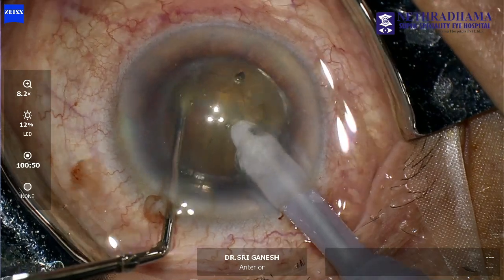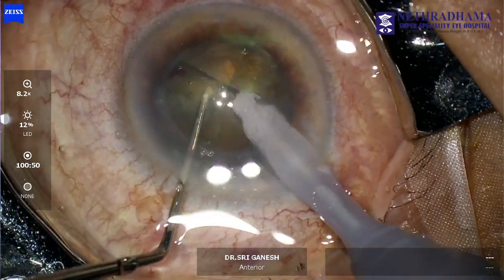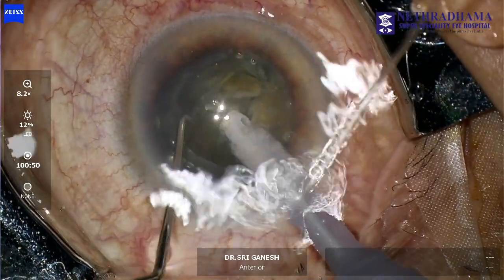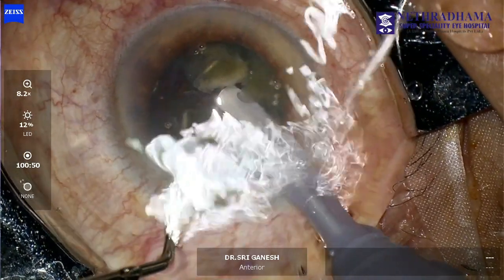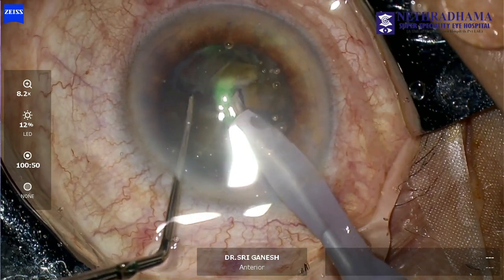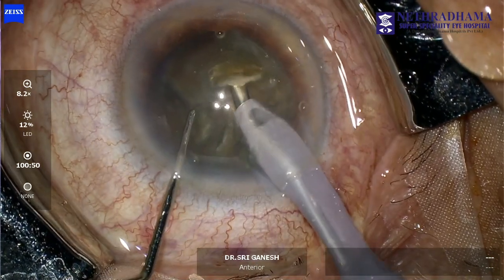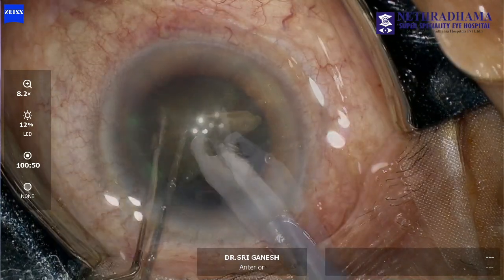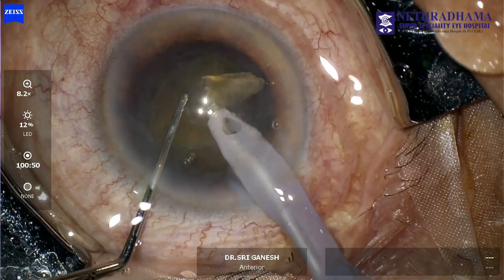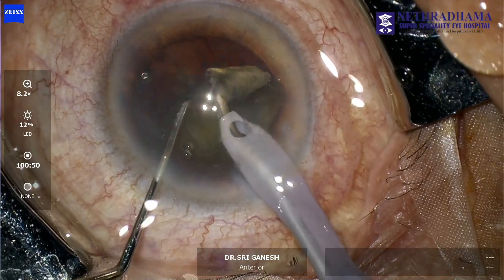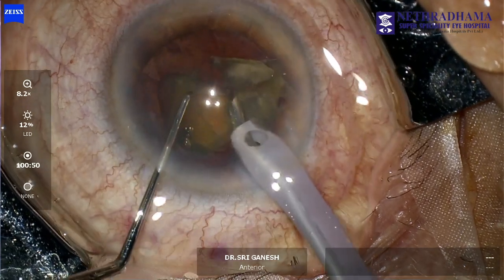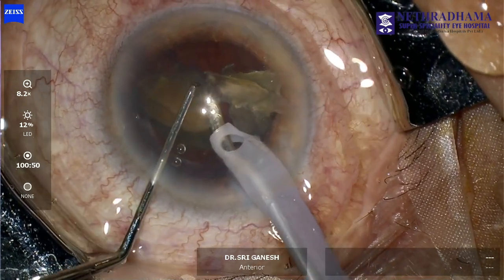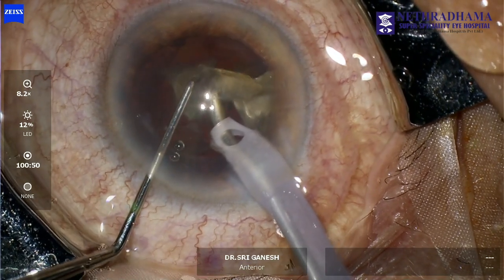Phacoemulsification is started. As you can see, this is a grade 3 plus cataract, fairly dense. The nucleus is divided and separated along the nucleotomy and then emulsified. Similarly, the quadrants are eaten up and this is the last fragment being removed — watch very carefully.